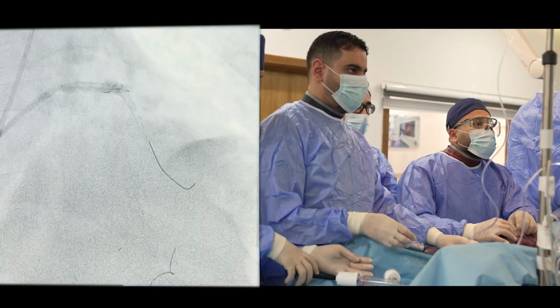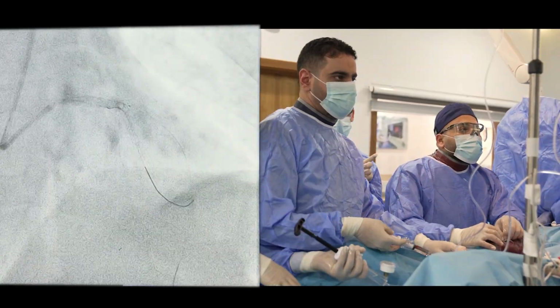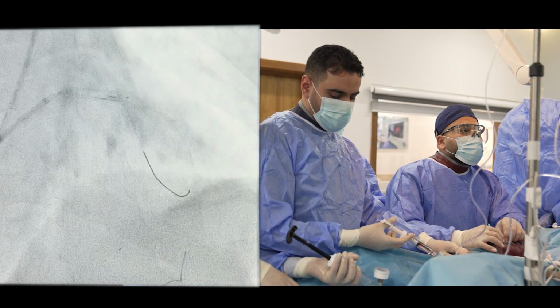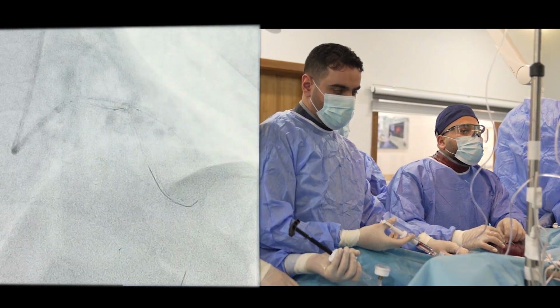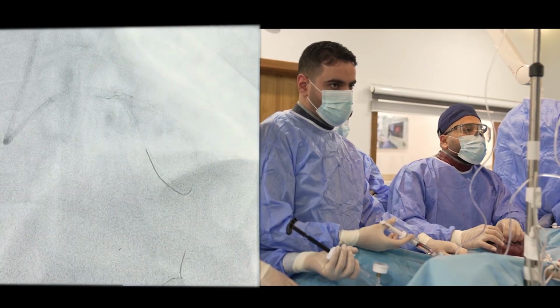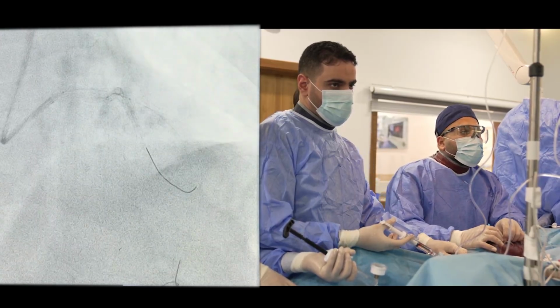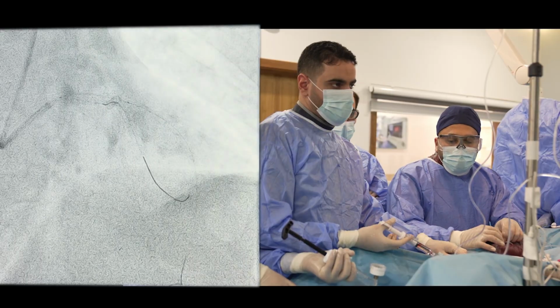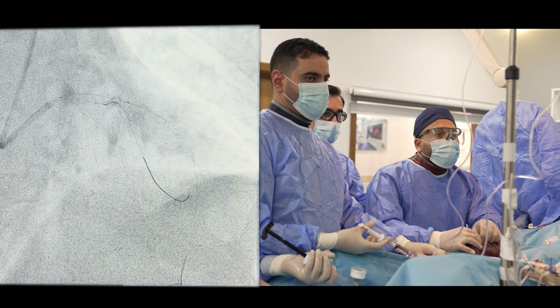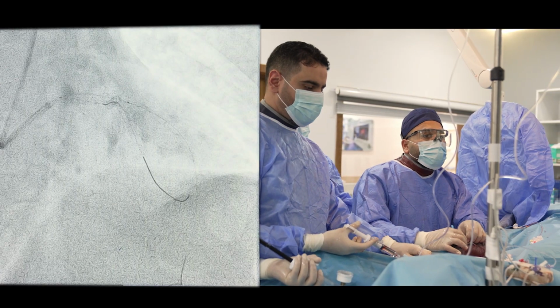Again, the pressure is coming down. The dye should be diluted. You see, it takes a long time to come down. Now the pressure is 90. It was 130. Yeah. Because we need to inflate more. What was the inflation pressure? 12? 12.